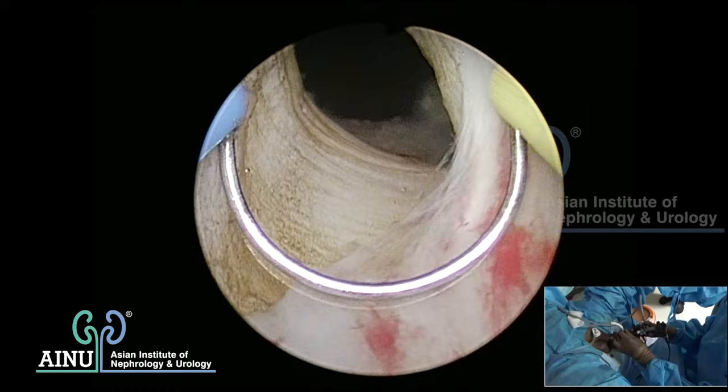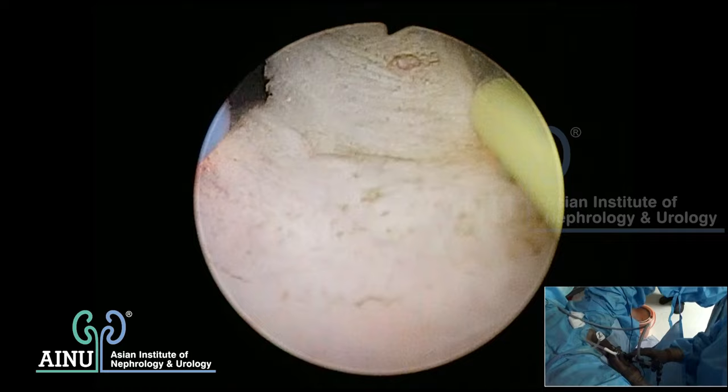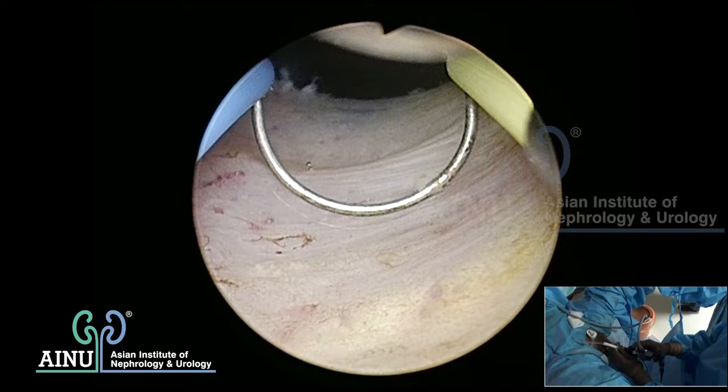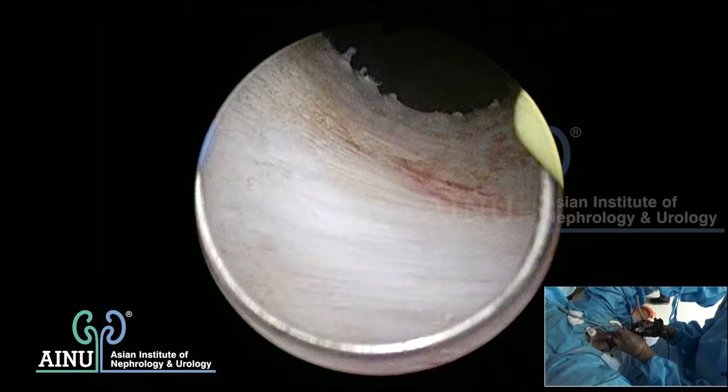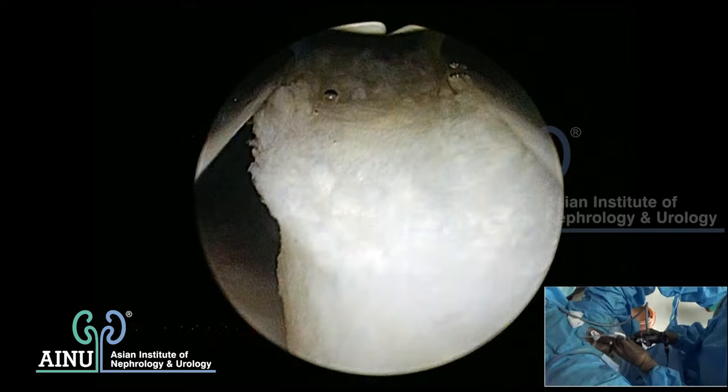After three cuts, you start seeing bladder neck fibers. I start doing the same on the other side. I did not find the vessel which usually comes at around 5 o'clock or 7 o'clock, but on either side I can see the bladder neck fibers. This is the median lobe sitting between the two grooves we created. Finding and coagulating that vessel gives a devascularized median lobe which can then be resected easily.